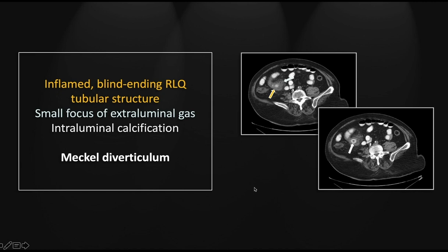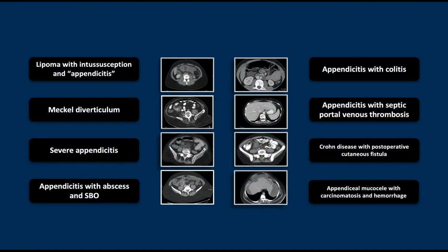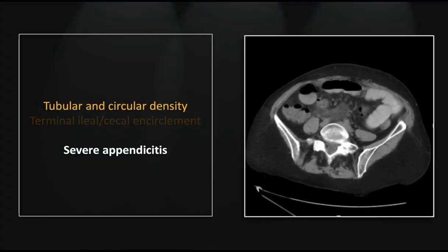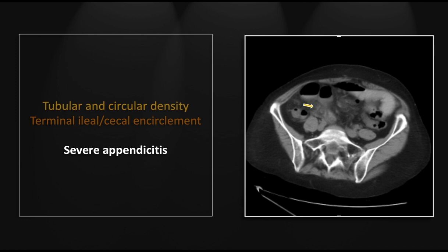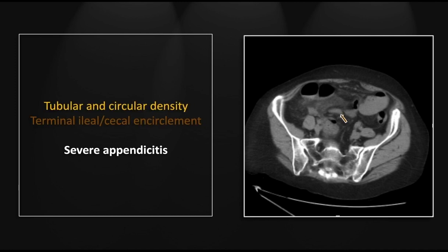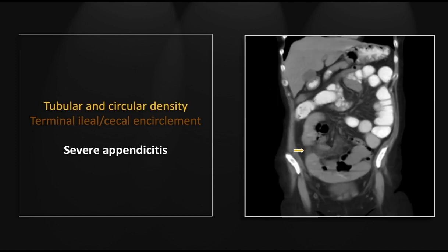Our next case is a severe appendicitis. You can get appendicitis so advanced and severely inflamed that the appendix practically disappears into just a mass of stranding. There is an arc of stranding and inflammatory change that actually forms a circle around encircled loops of terminal ileum. On the coronal, you can also appreciate the tubular and circular nature of that inflamed appendix.